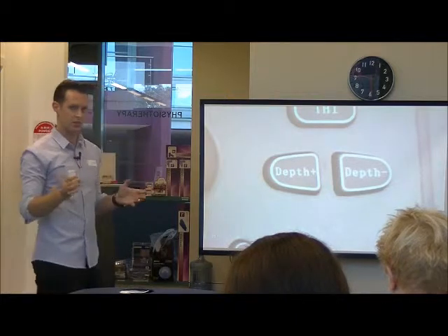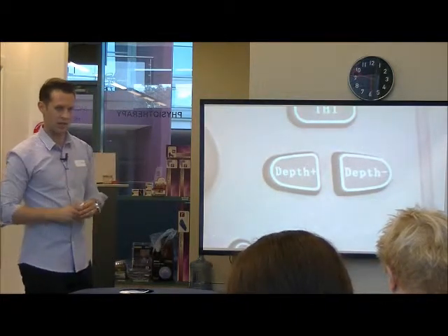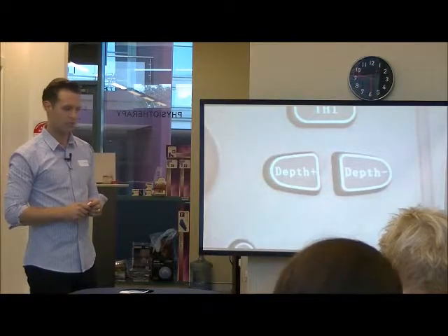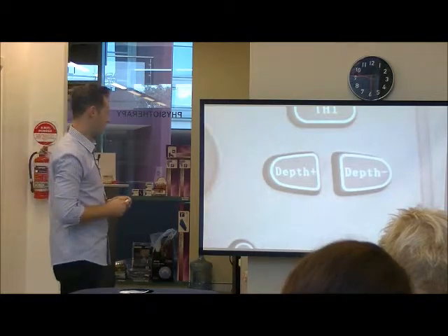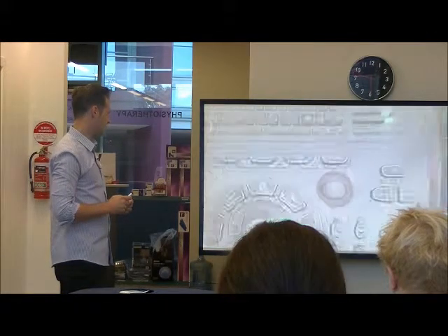So the only thing that's important to know about that is, if we have the depth set too deep, we might not get the focus in the right position. If we have the depth set too shallow, again, you might not get the focus in the right position, or you might not even be able to image what you're looking at. So we'll have a look at adjusting the depth to get the optimum image.